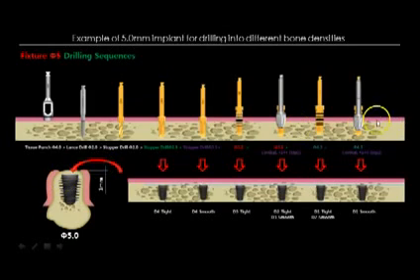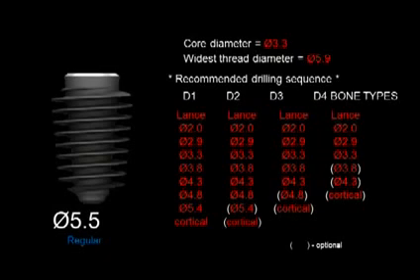And if you have dense cortical bone up top, what you can actually do is drill out to 4.8 up here with your 4.8 by 7 stopper drill, and then leave the under portion, or your half of the portion in your cancellous bone, at 4.3. So you can augment your surgical procedure as needed for you, and we do give you all the tools to be able to do that with. So that's a really, really strict point. I wanted to show you that as well.